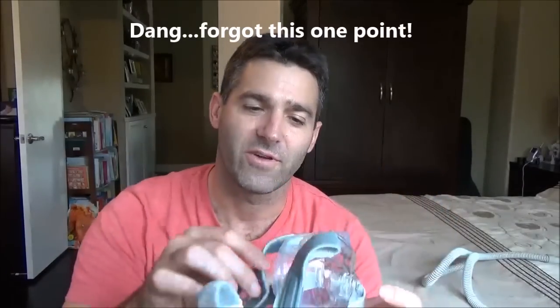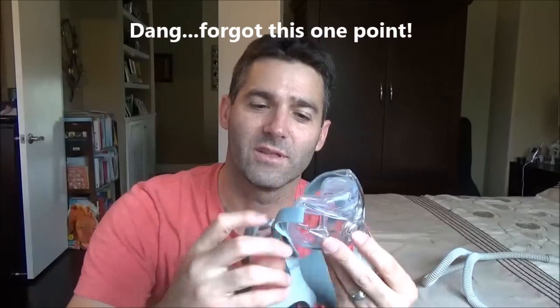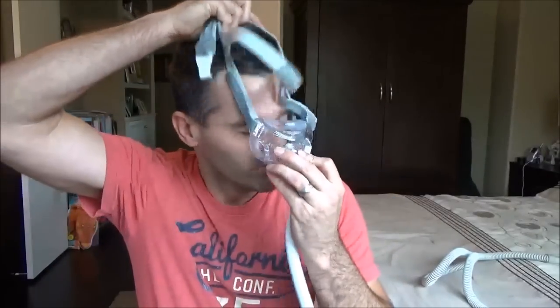If you do use this as a daily mask, I would highly suggest some padding under there, because I mean, look at this. That thing's rigid, man. What the hell? Come on. One last thing with the Amara View is I found that the angle of these straps, let me just put it on because it's easier to visualize than it is to tell you about it.